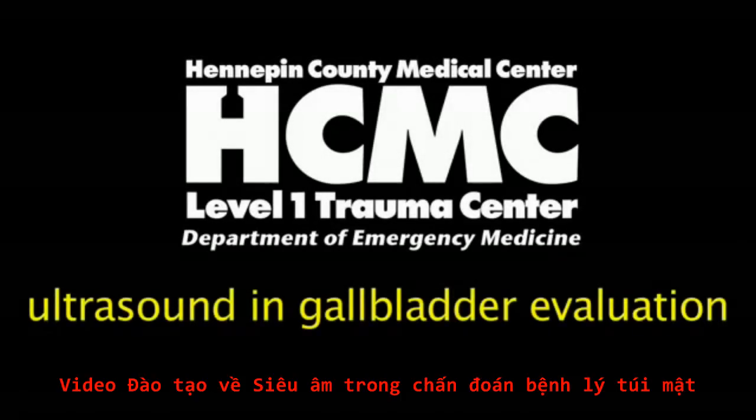Welcome to the Hennepin County Medical Center training video on the use of ultrasound in gallbladder evaluation.